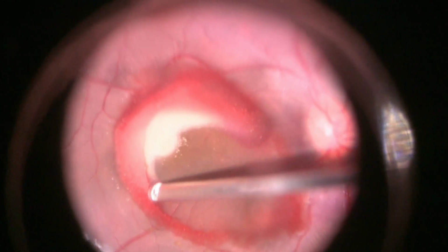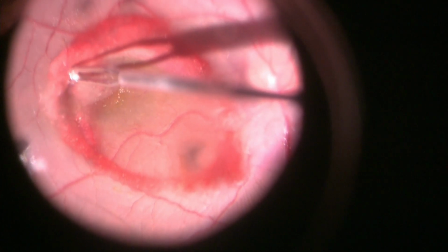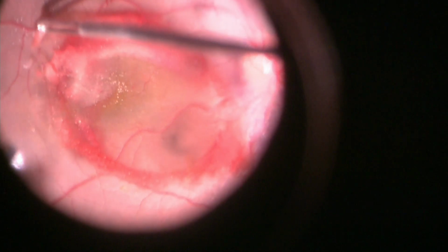Dehemoglobinized component of the blood was also revealed. The circumferential rim of the ILM was further removed to expose the residual blood.